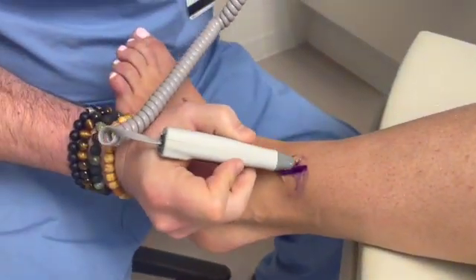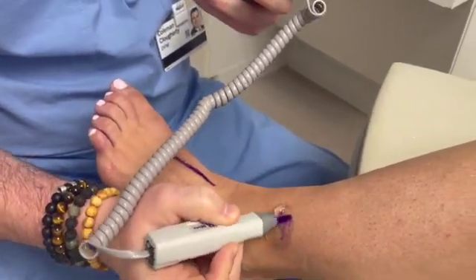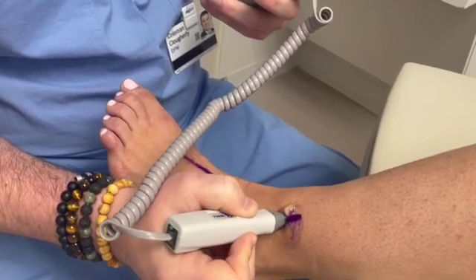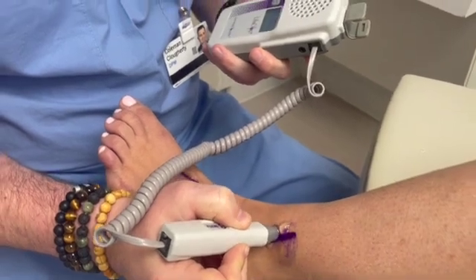Using the same gel, we're going to move over to the perforating peroneal artery. This one you may need to move up and down a little bit to find it. You want to get that triphasic pulse at the peroneal artery as well, and now we'll move on to the right foot.